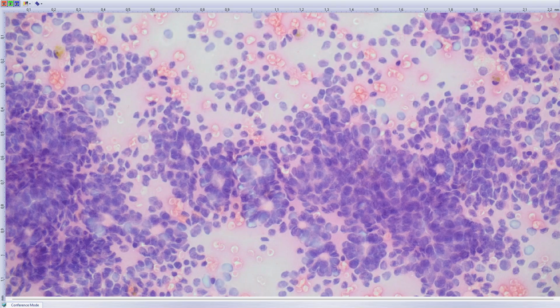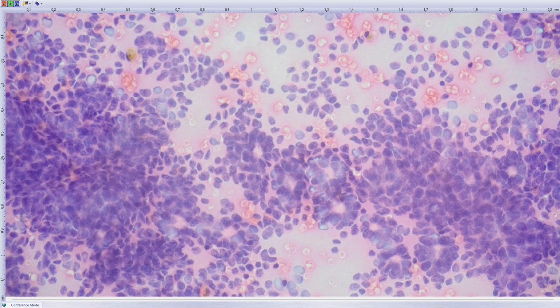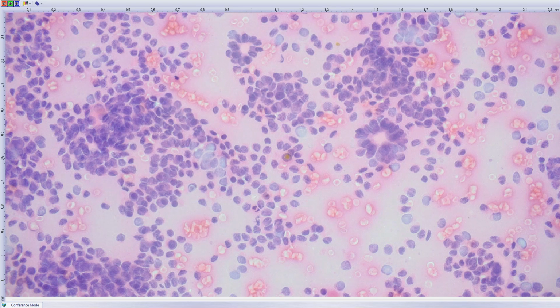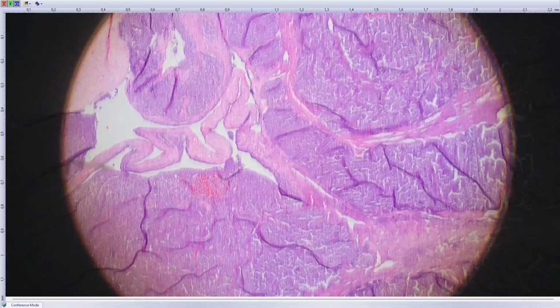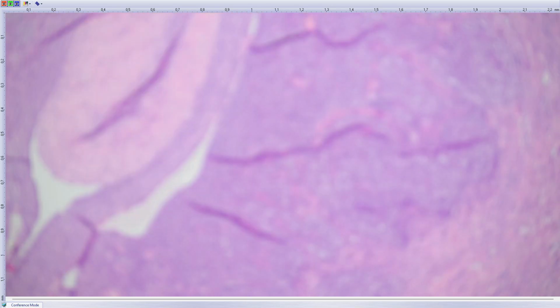And you can see these oval cells with some grooving, or let's say coffee bean morphology, and even in cytology you can see these rosettoid structures, which are called Call-Exner bodies, and the diagnosis is granulosa cell tumor of adult type, and this is the definitive biopsy of the lesion, which recapitulates what we have seen in frozen.